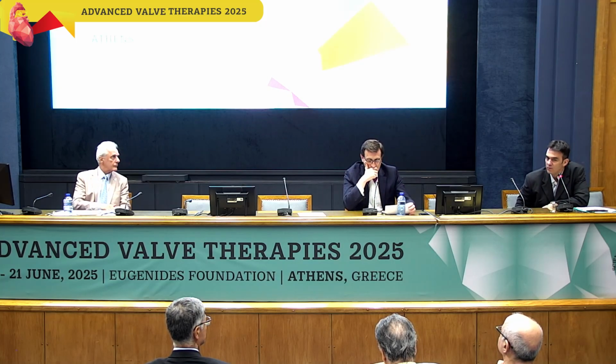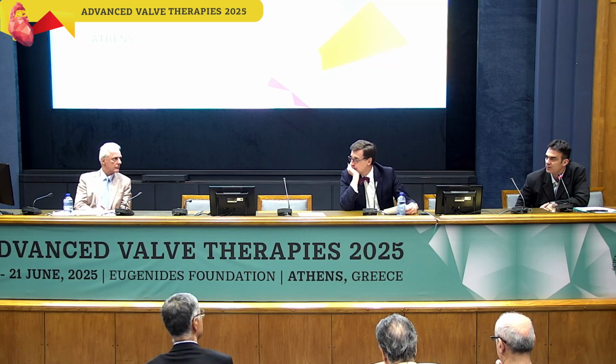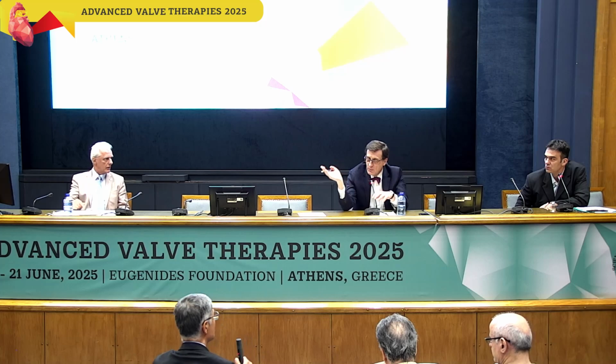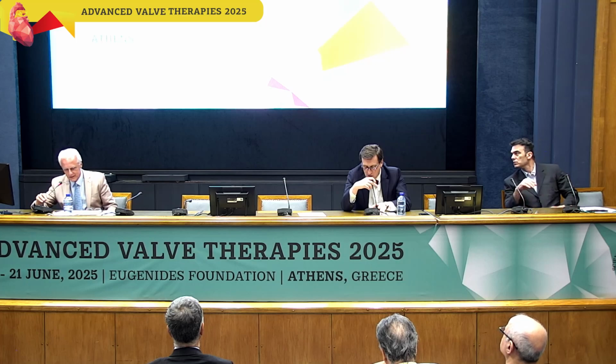We know when we perform edge-to-edge repair for mitral, we go for a 0 or 1+, but in this patient, who is a candidate for heart transplant, we were very happy with the actual result, because her destination, her therapy is going to be heart transplant. Thank you very much. So anybody, any questions from the panel? Dr. Athanassopoulos, tell us a little bit about the timing of transplant and how did it go in your system?